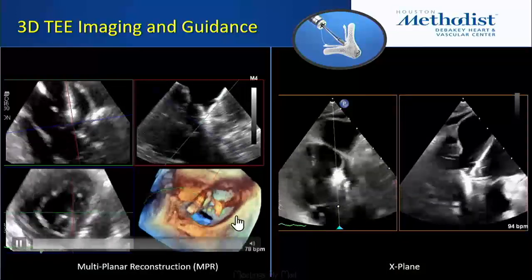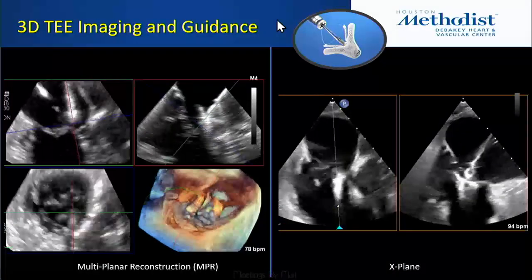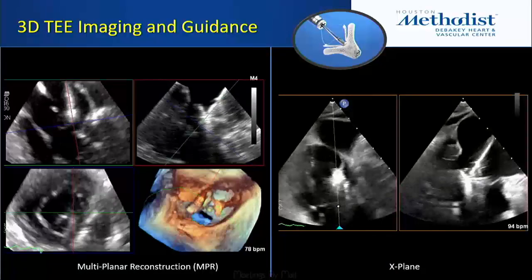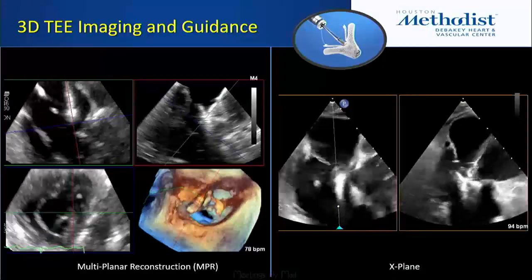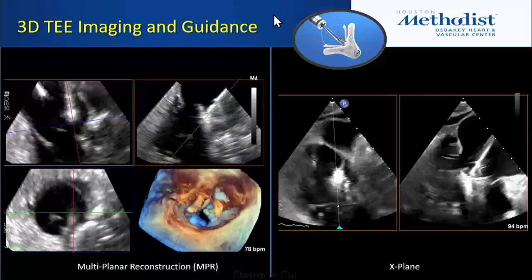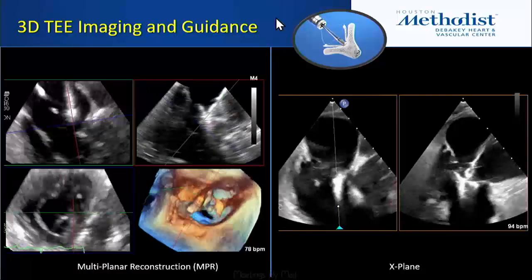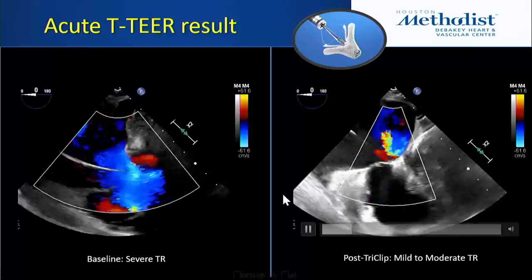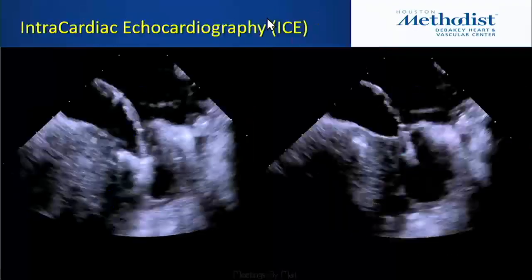And then we use a lot of MPR, so I guess this is advanced. And MPR we're using more and more because the probes are better, the software is better, the tissue resolution is better, the temporal resolution is better. So if you tried MPR 5 years ago and you didn't like it, that was a different experience. It's actually better now than it has ever been, and we're using it more and more. Again, this is why we do this imaging, to see the difference.